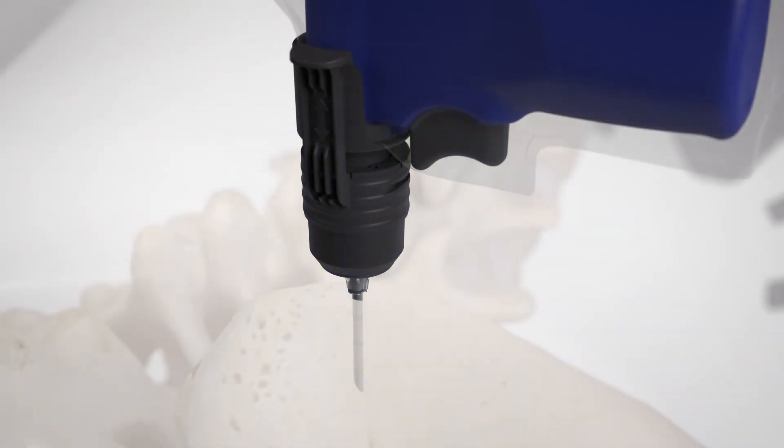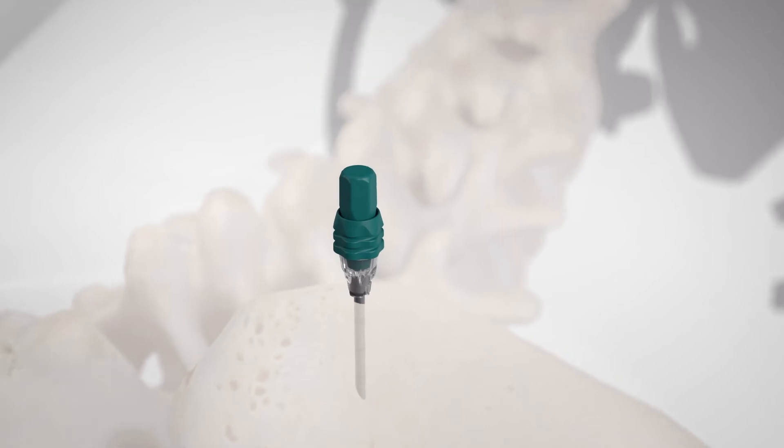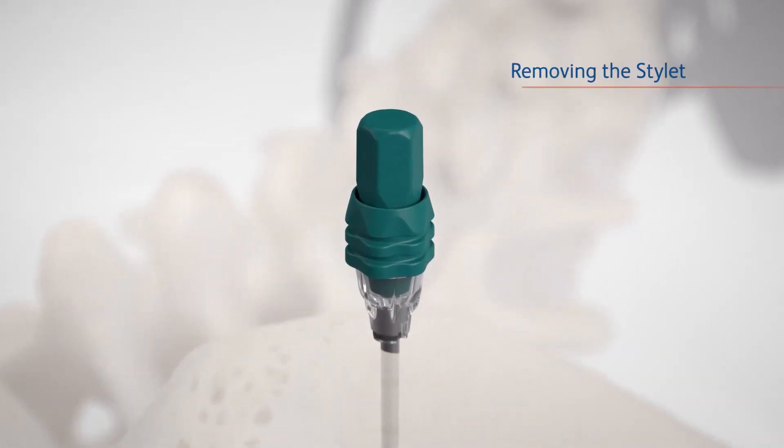To disconnect the power driver, push the release arm forward and pull the driver away from the needle hub. Remove the stylet by turning the stylet hub counterclockwise and remove, leaving the introducer cannula in place.